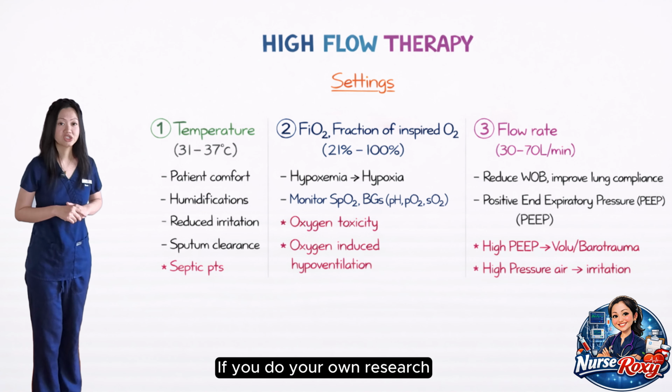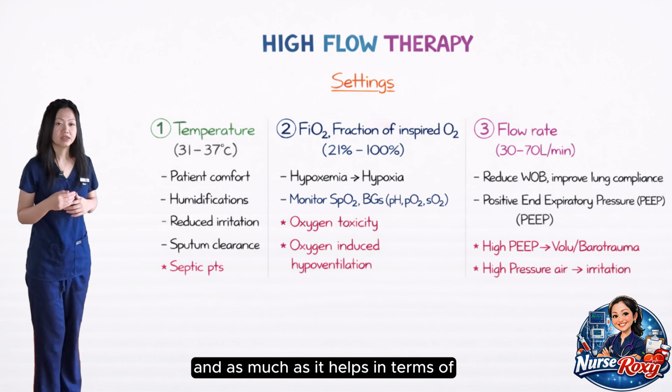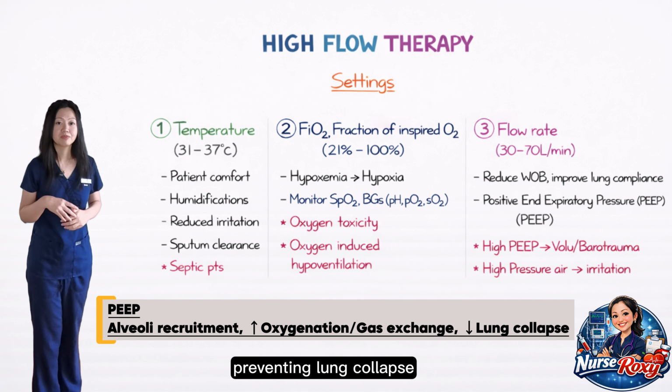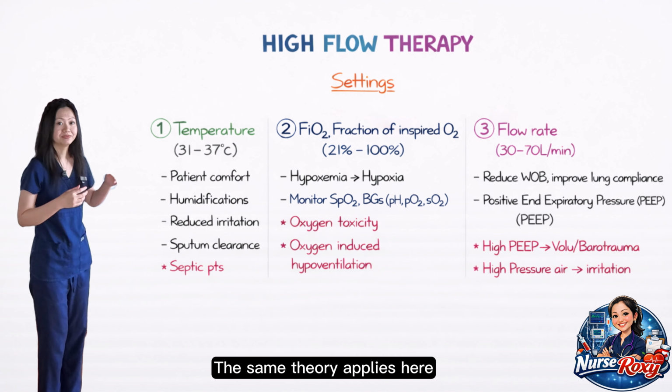If you do your own research, there are so many benefits of PEEP. And as much as it helps in terms of recruiting alveoli, improving oxygenation and gas exchange, preventing lung collapse, it can also do harm to our body. Let me give you an example. Imagine you are squeezing a water bottle. The pressure within that water bottle increases as you are squeezing it, and it will reach the point that the water bottle explodes. The same theory applies here.